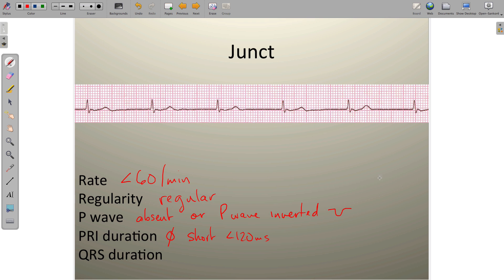That should make sense — if the AV junction is depolarizing from right here instead of all the way up at the SA node, the amount of time needed to travel is less. So the P wave itself will look a bit shorter and the PR duration tends to be on the shorter side.